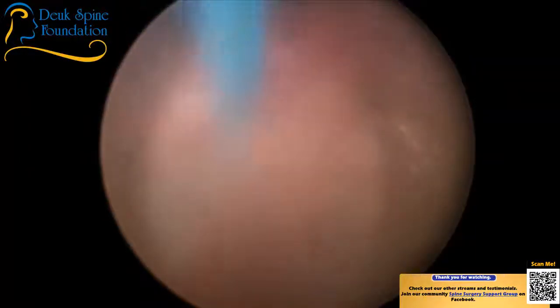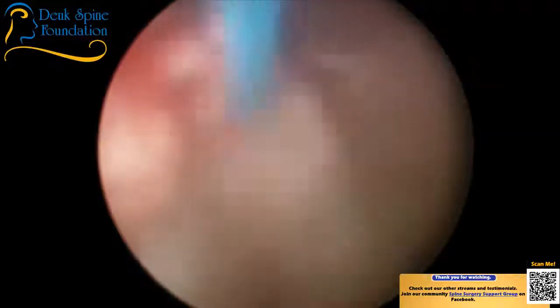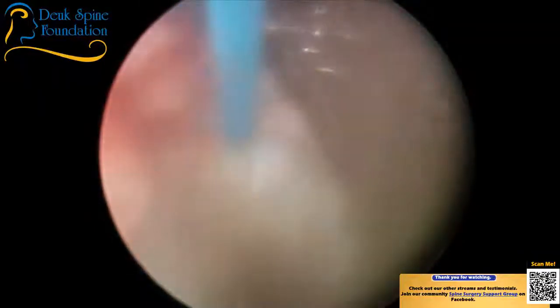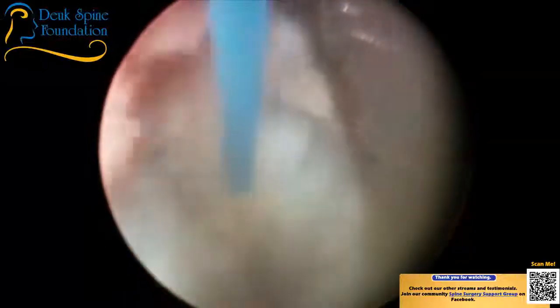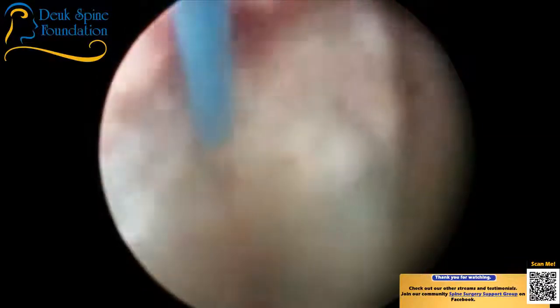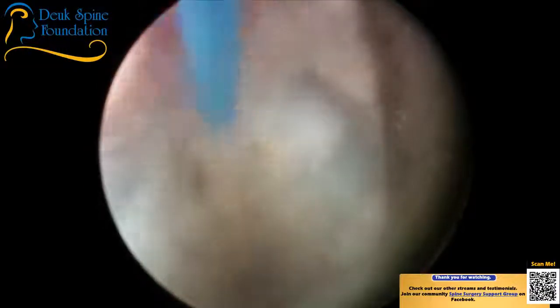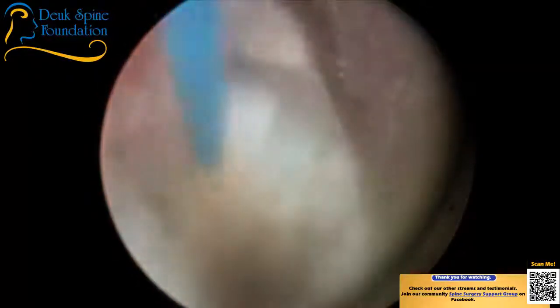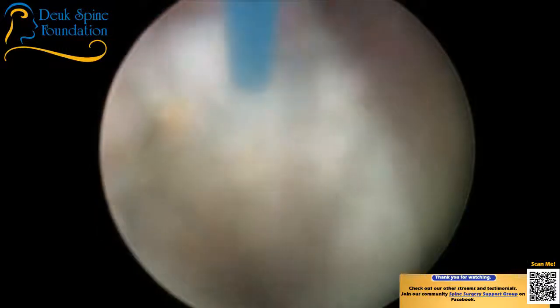Now the laser can actually stop bleeding. But that's not its primary purpose. And the amount of bleeding we're having is so minimal. But I'm almost done repairing this tear. And unlike the earlier surgery, I can still see pretty darn well. So I don't need to bring in the grabber as my technique to be able to see.